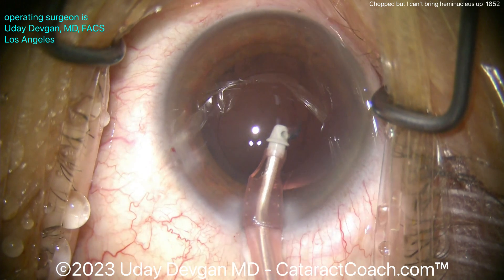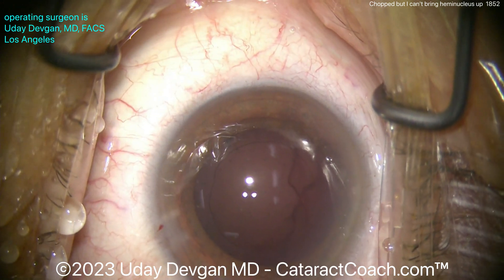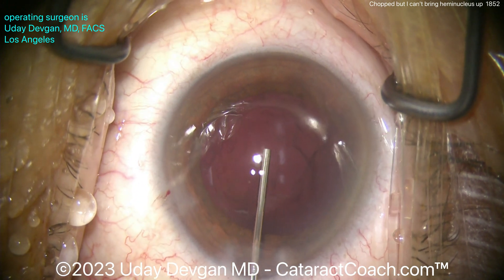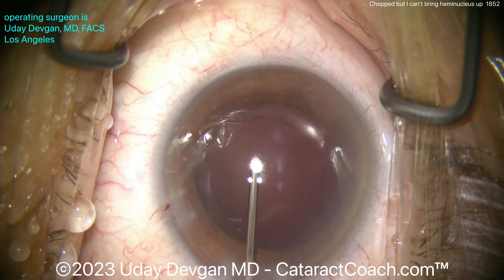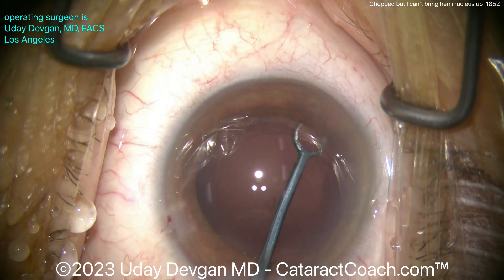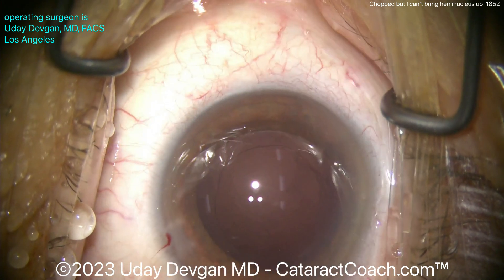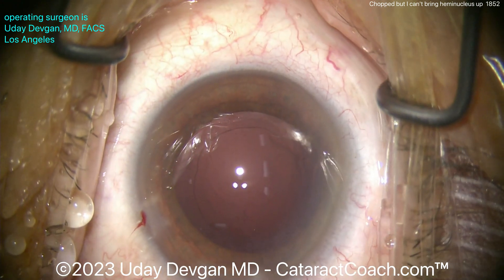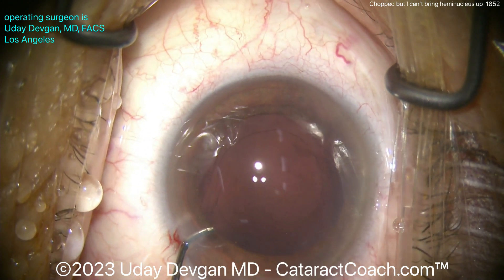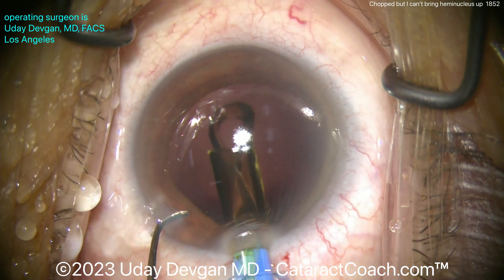There are other issues too. If you don't have great settings — say you have too much vacuum and the nucleus is too soft — you try to vacuum through it and it just goes right through the piece. Sometimes you have that crumbling nucleus that's a little too soft; that can be an issue. If the fluidic settings aren't appropriate and you don't have enough vacuum holding power, it can be tough to bring pieces up out of the capsular bag. Also, if you have a loose connection on your sleeve, your tubing, or your aspiration tube on your handpiece isn't fully tightened and you have a little leak — that could be an issue too.